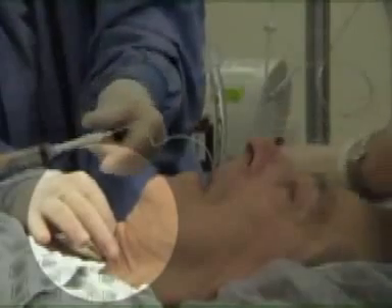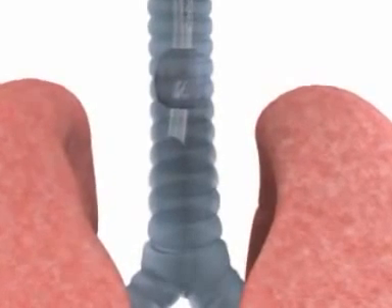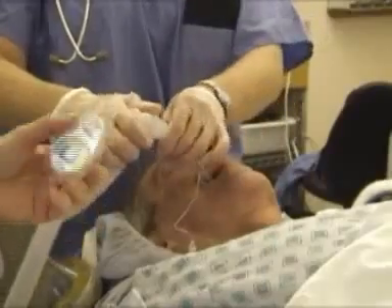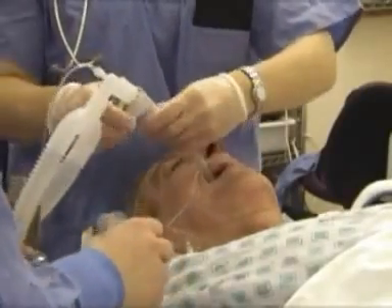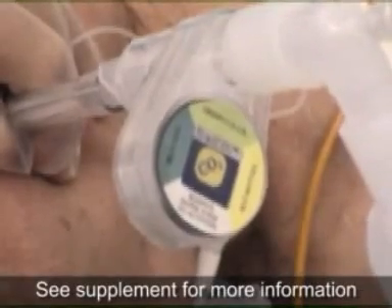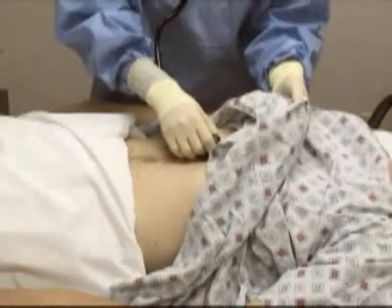The assistant must maintain cricoid pressure until tube placement in the trachea is confirmed. The end of the endotracheal tube should lie in the mid-trachea, 3-7 cm above the carina. A good rule of thumb is 22 cm at the teeth for the average size adult. Place the end-tidal CO2 detector onto the endotracheal tube and attach the ventilation bag, administering a few tidal volume breaths. Carbon dioxide will be reliably and consistently detected within the first 6 breaths of an endotracheal intubation and with each exhalation thereafter, except in some cases of cardiac arrest when gas exchange may not occur. Assess secondarily for esophageal tube placement by auscultating over the stomach during positive pressure ventilation.